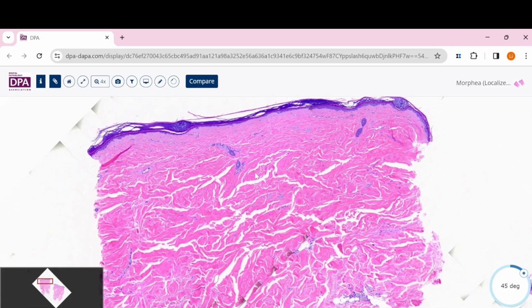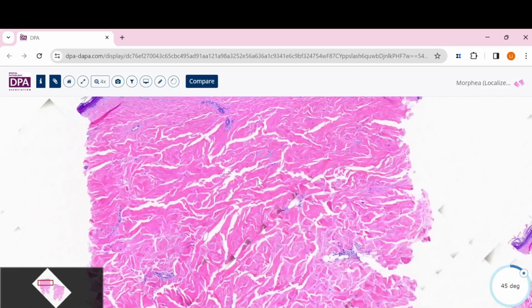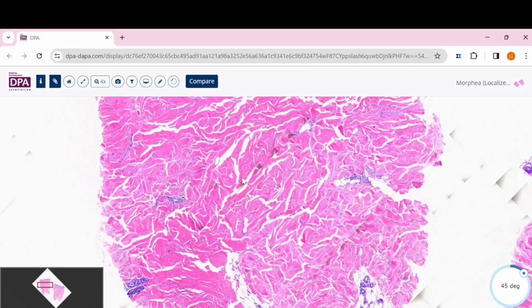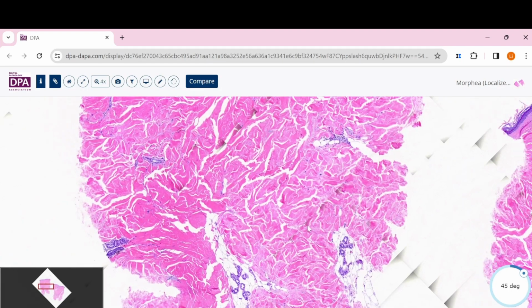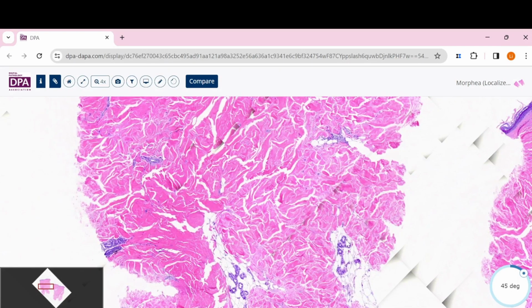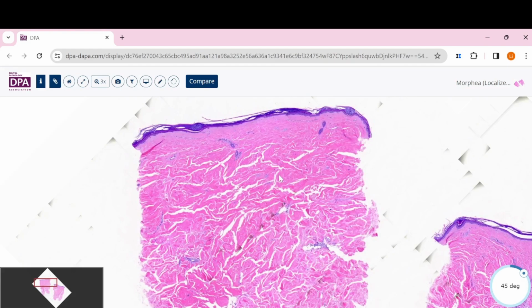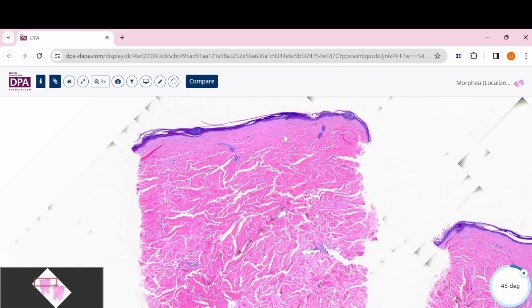You can see we do not see any hair follicle. We just see maybe this is a vessel, but do not see eccrine gland, maybe here, but just deep, just not in the superficial. But as we know in lichen sclerosus, we need to see this sclerotic collagen up in the superficial dermis, not going deep down. And then we have tons of lymphocyte inflammation in the deeper area. Okay.